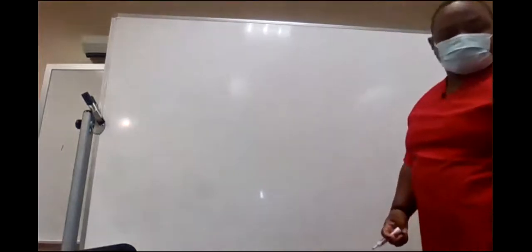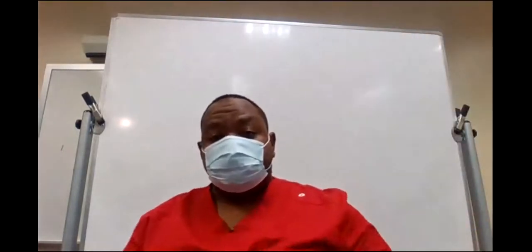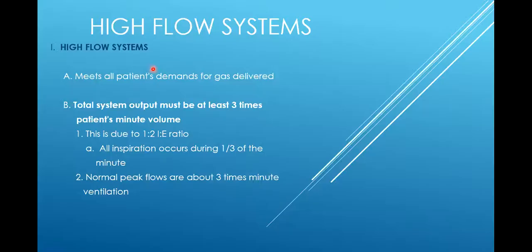Now we're getting ready to go into something a little bit deeper. Let me see what I got in this PowerPoint. High flow systems meet all the demands of the patient. Total system, the system that you have designed must be at least 3 times their minute ventilation. So that means you got to meet their demand.